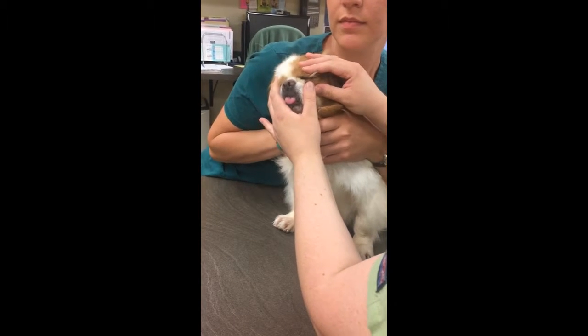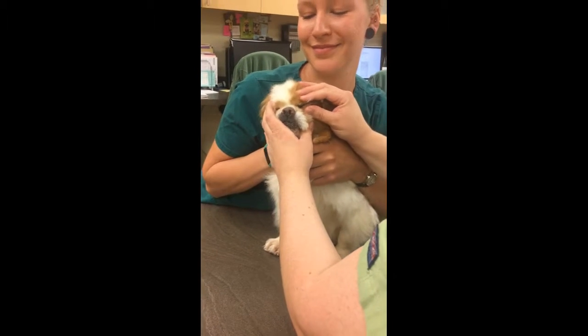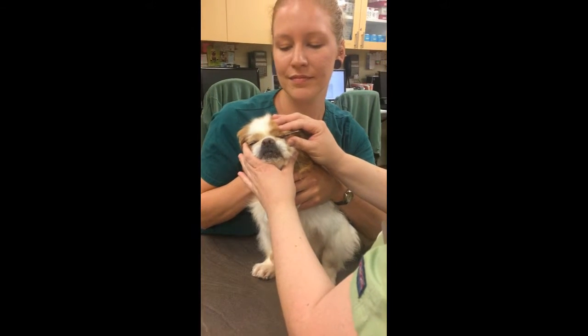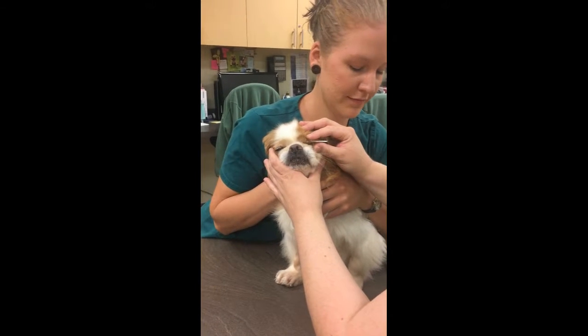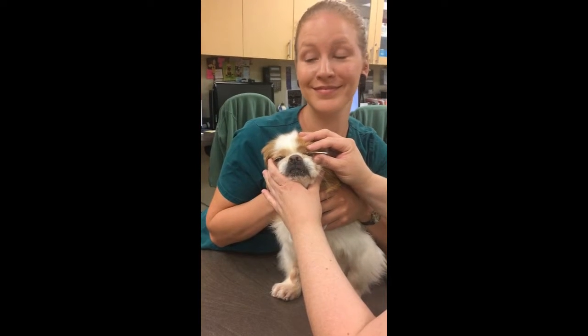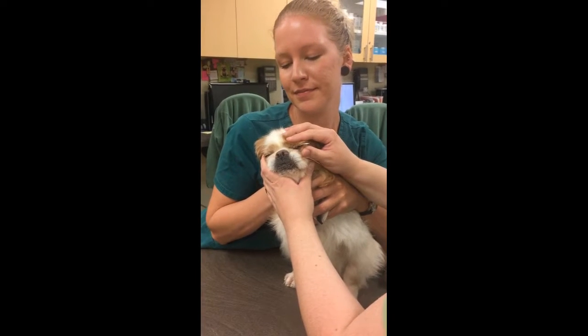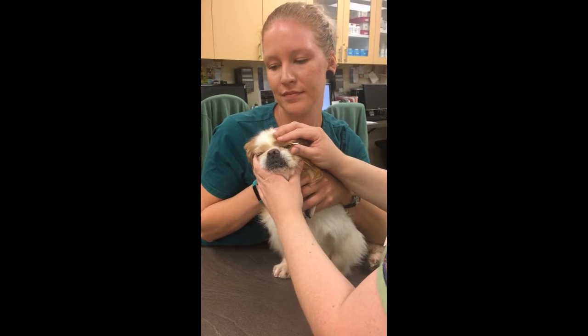And then we're gently just going to hold his eye closed for 60 seconds. It's not causing any harm to the patient — we're not putting any pressure on the eye. We're just going to wait our 60 seconds, keeping our strip in the whole time.